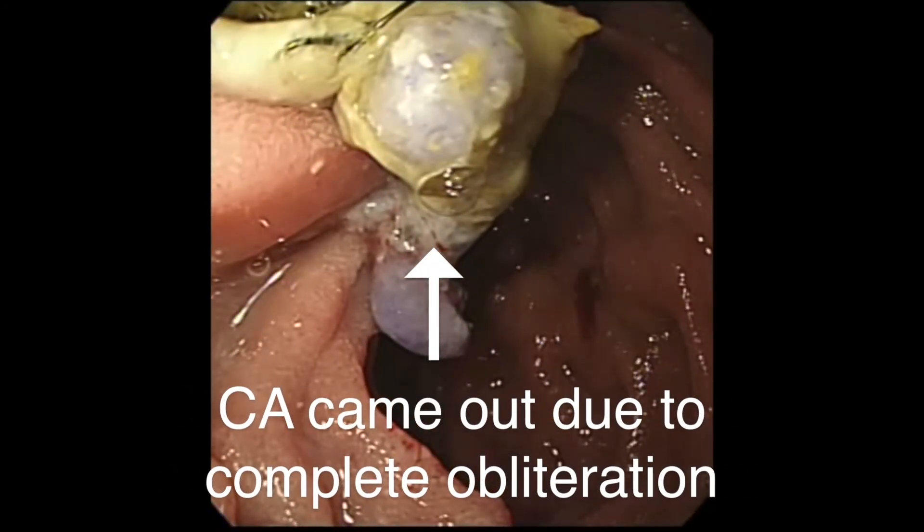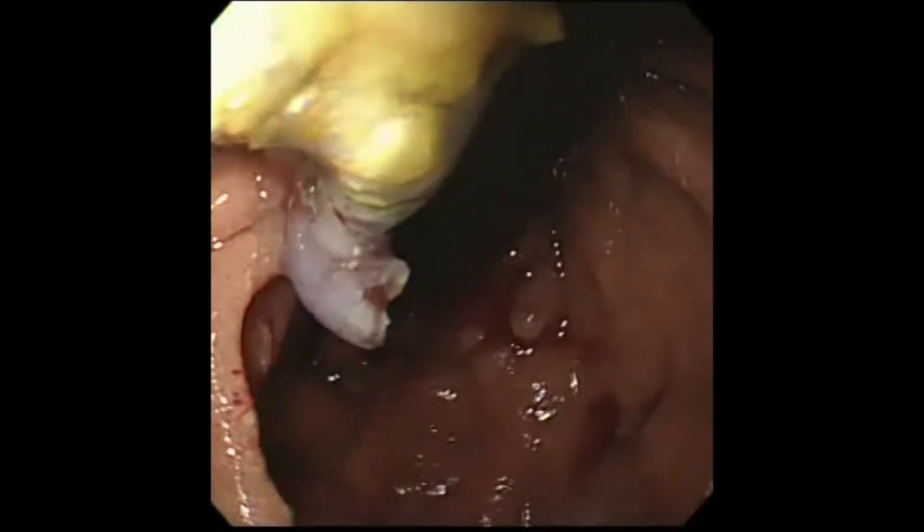Two months later, endoscopy was performed. As shown in the video, cyanoacrylate was seen to come out of the varix due to complete obliteration.